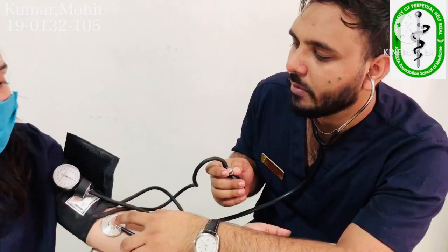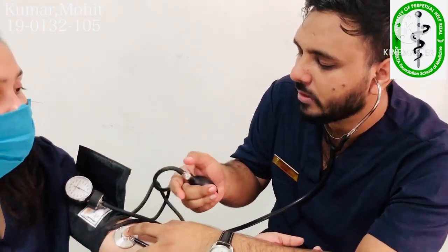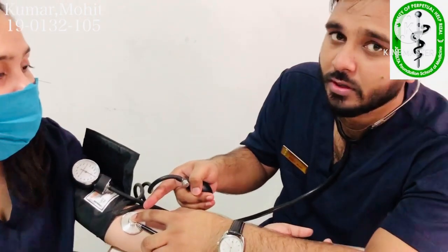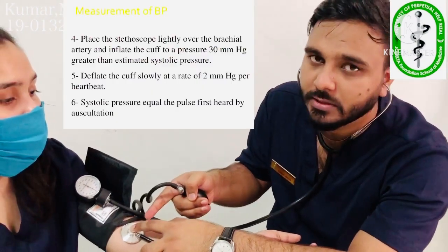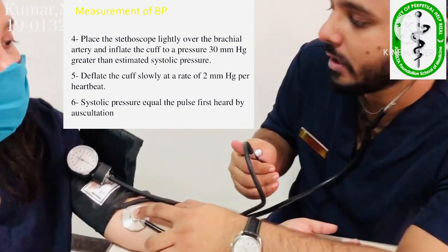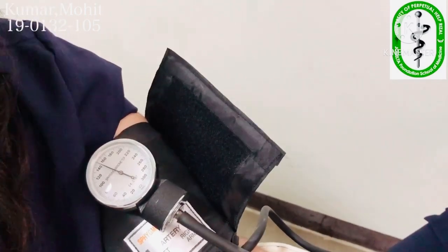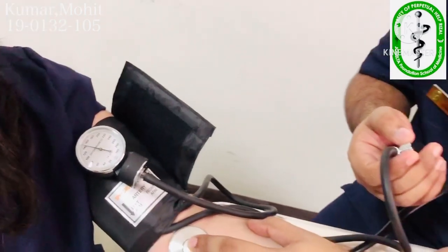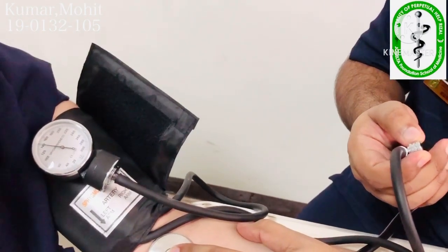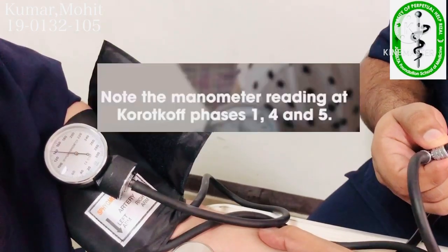We have to inflate up to 140 millimeters of mercury. Before that, we tighten the valve and place our stethoscope's diaphragm on the brachial artery in the antecubital fossa. Now we inflate up to 140 millimeters of mercury, and then deflate at a rate of 2 to 3 millimeters of mercury per second — it should be going down slowly.